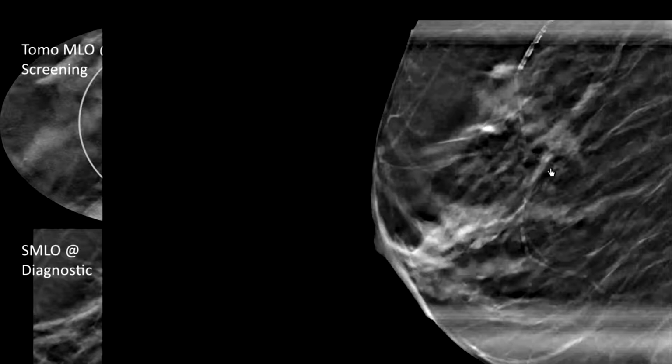And it's not going. But you're just going to have to take my word for it. But that's, again, what you're looking for in those TOMO slices: are you continuing to see that spoke wheel pattern, or are the lines actually going through, or are they curved?